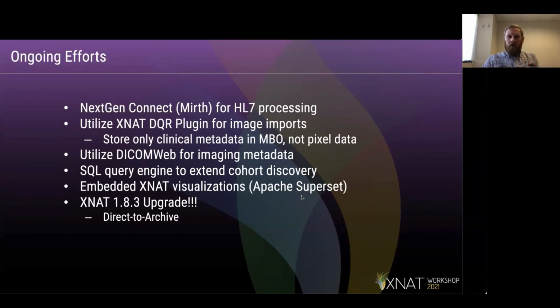DICOMweb. I don't know how many times I've been pining for that through the talk here, but I think that would be a huge benefit for imaging metadata, as opposed to having to do multiple C-FINDs. We could just do things at the study level.